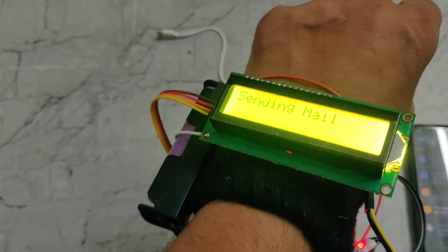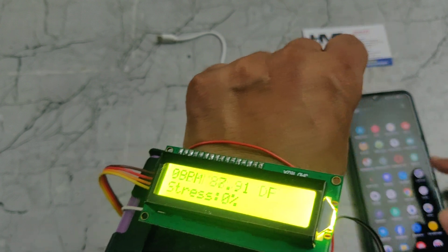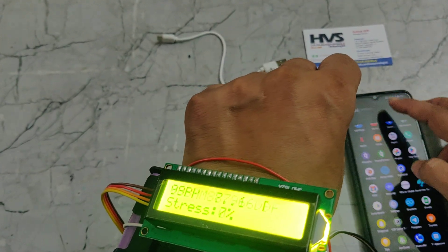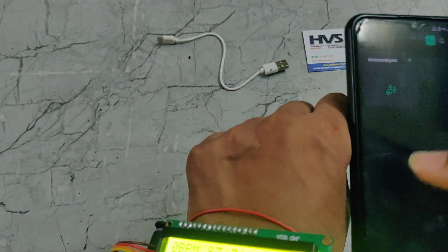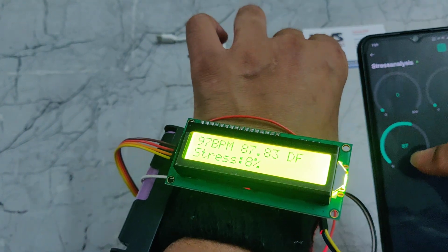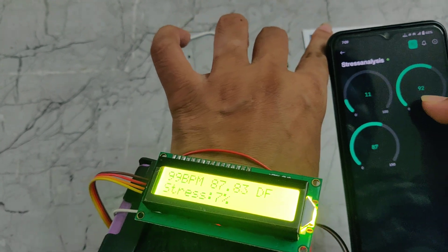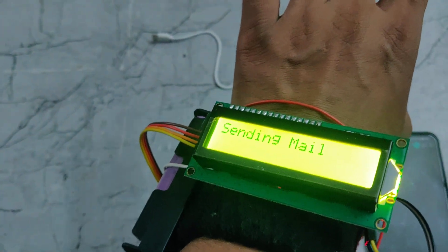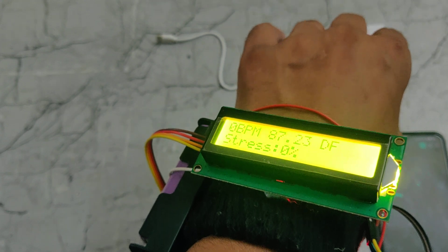In this way, it will send a message using email. We can also monitor the values in the Blynk app. We need to go to Blynk IoT — when we log in with the email and password, it will show the interface. Here we can see the temperature value, the stress level, and the BPM values displayed. Whenever the BPM crosses more than 100, it will send an email alert to our phone. This is how this system works.